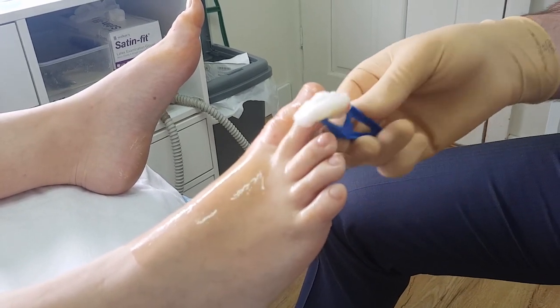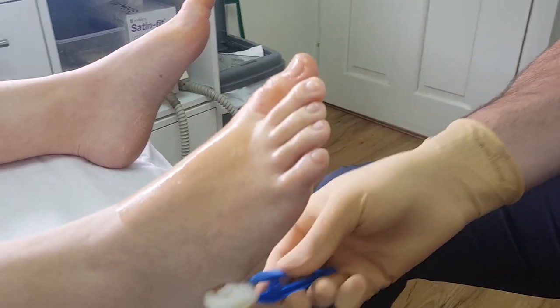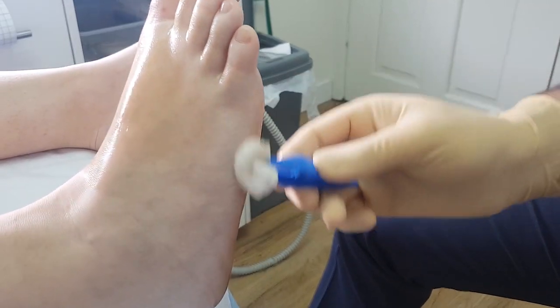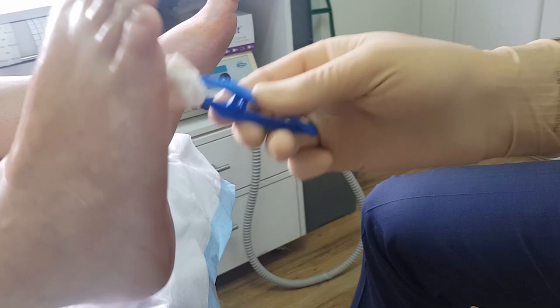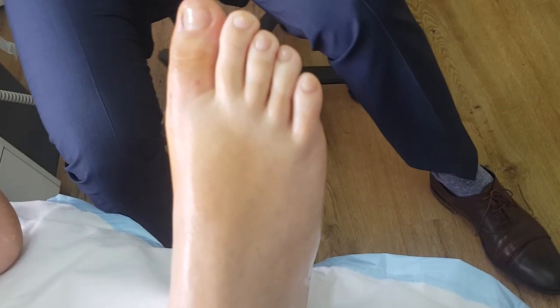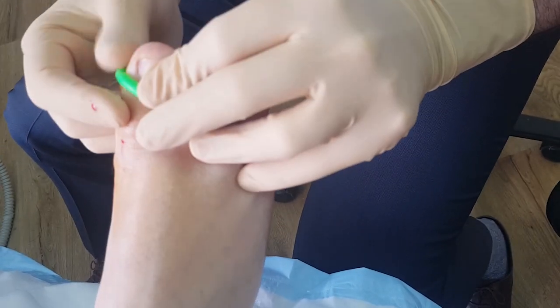We'll be doing the medial lateral sides of both hallux. We're just prepping with chlorhexidine solution. Now you don't even have to put the chlorhexidine here, but if you really want to irritate your patient just put it on there. We've already tested that the toes are anaesthetised.